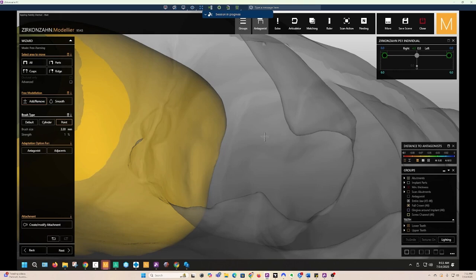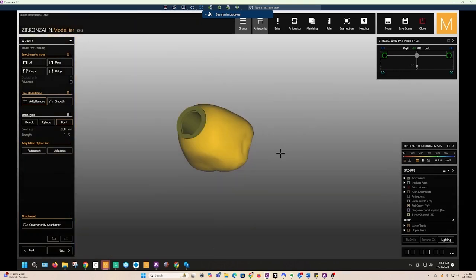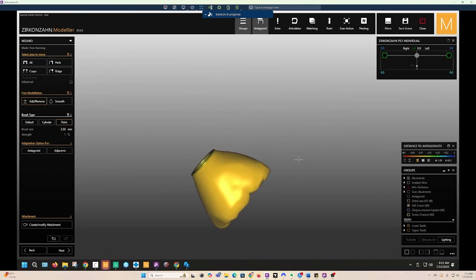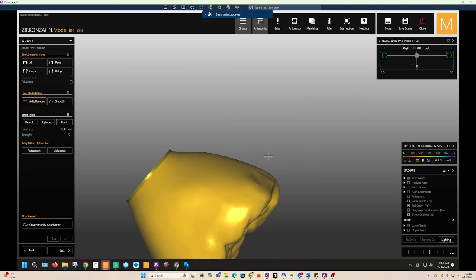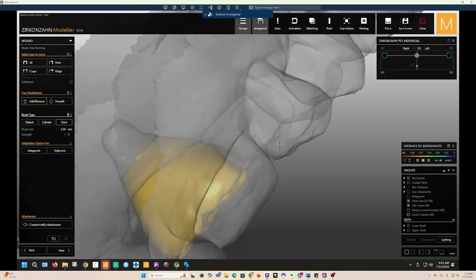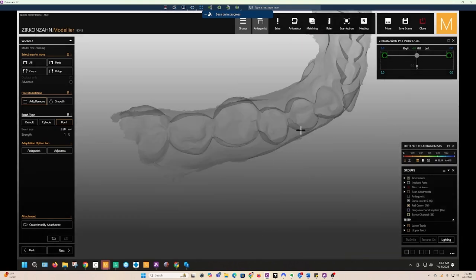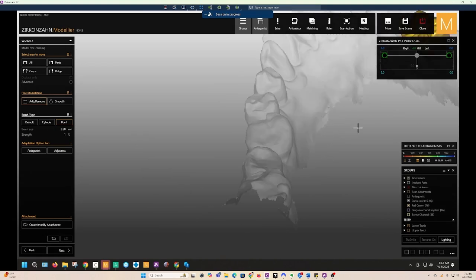A little bit of contact is going to be okay. Now, can you see this? You may have to adjust this area as you're inserting, but maybe not. It's very bumpy, but I don't want to go adjusting the adjacents again because it made it really ugly.